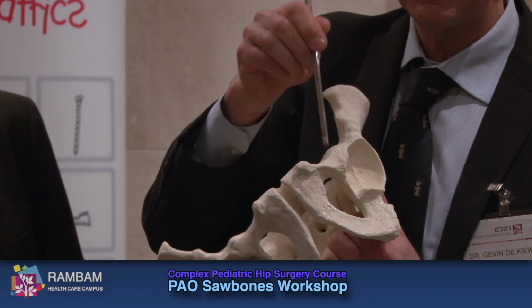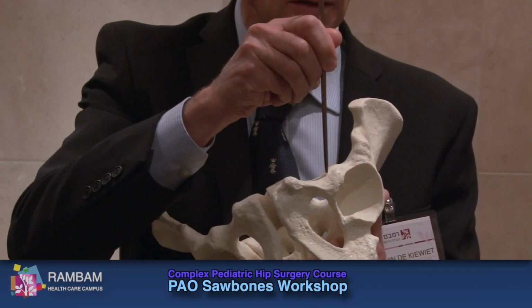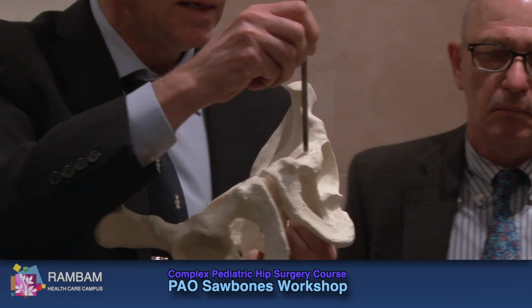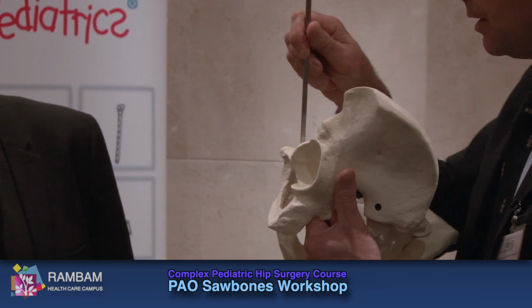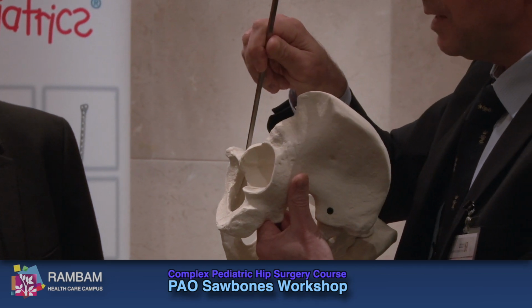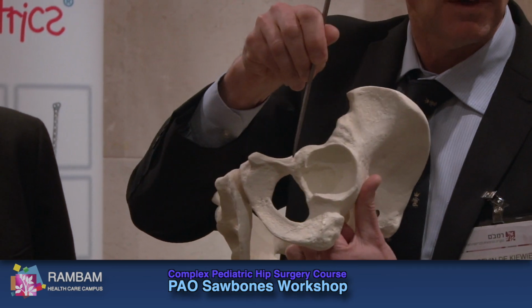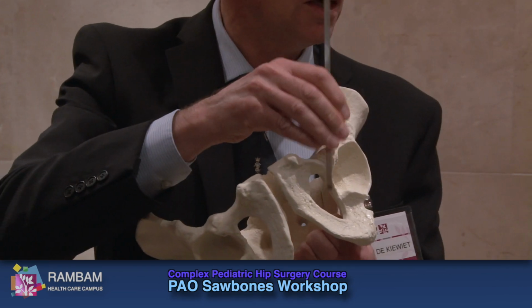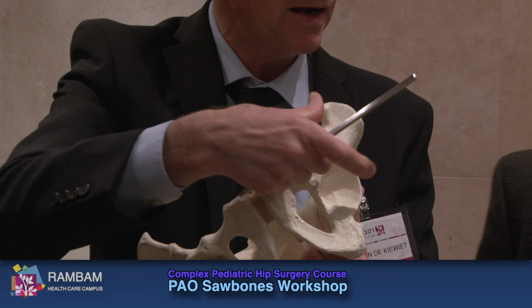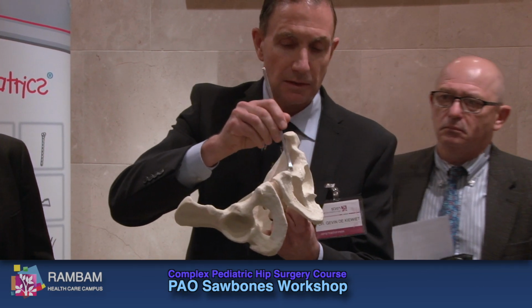You see, that's the iliopectineal eminence here. As long as my osteotomy is medial to that, I will always be outside the joint. Can you see that? As long as I'm medial to that, I'll be outside the joint. That's very important. So you can start your osteotomy there and then go medial to that, and you angle that down in that direction. Right? As Scott was saying, that angulation is important because you want to rotate that fragment, but you want stability as well with that fragment. Do that cut, that's the first cut.